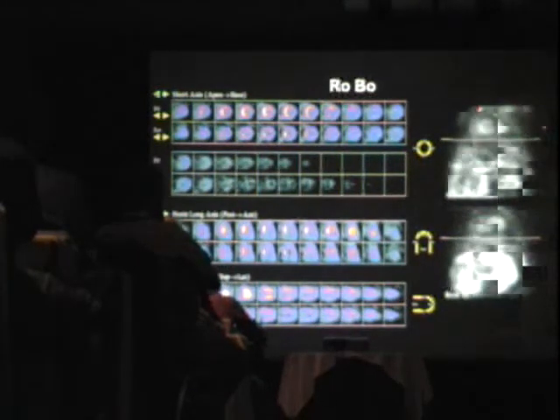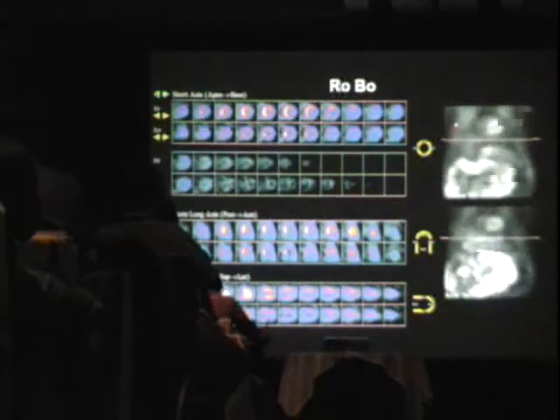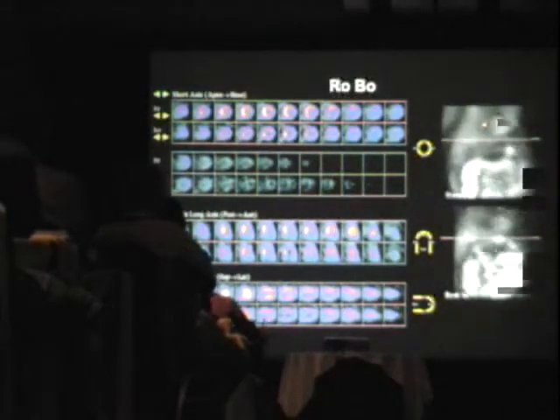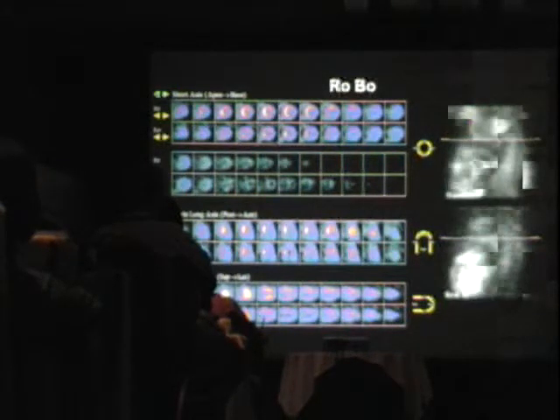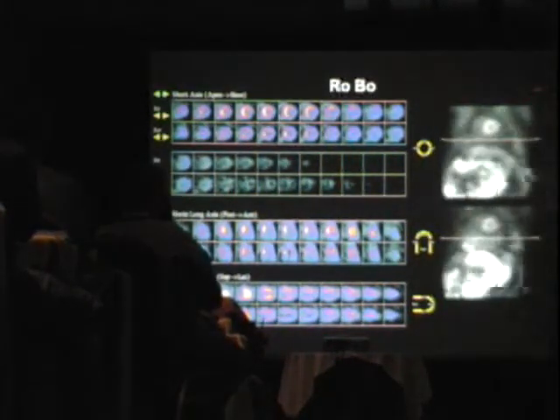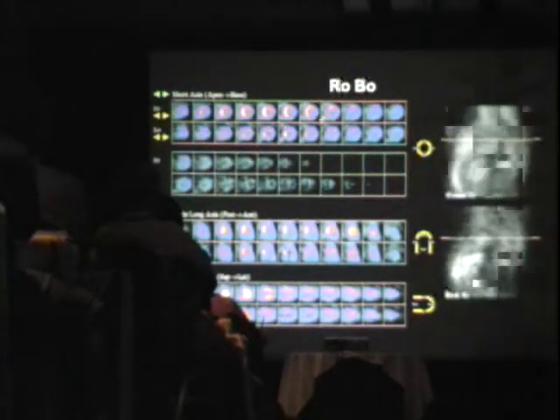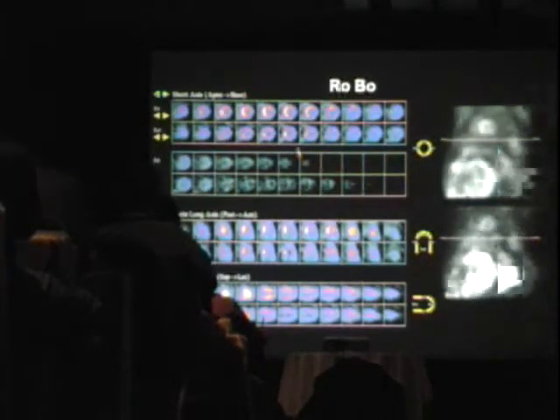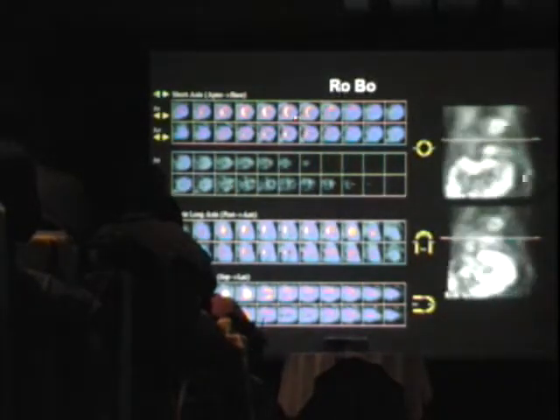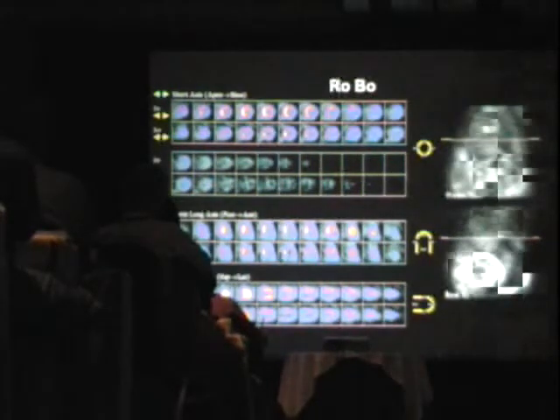So there's minimal stress, and when you look at the scan, you get something like this. Looking at the images, there is some degree of lung uptake; you can see the delineation of the lungs in relation to the heart, and they seem to have at least moderate uptake. There is uptake in the muscles, but it is a good quality scan. The scan shows a very modest defect in the lateral wall, showing reversibility. So you would conclude that there's mild ischemia in the circumflex territory.